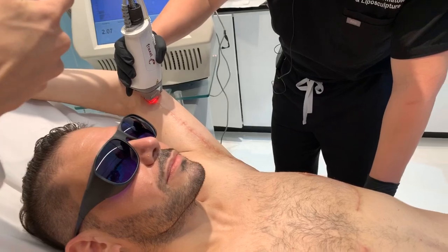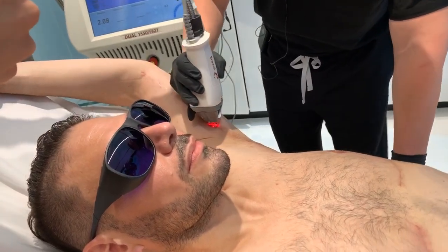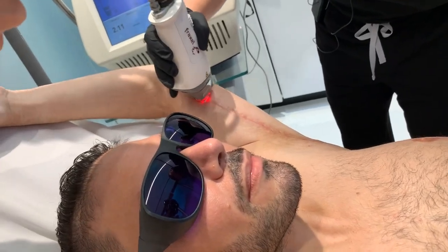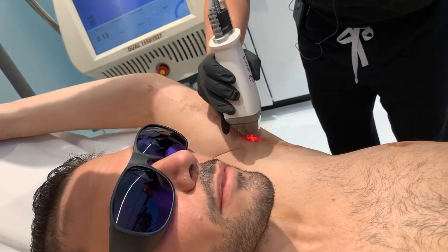And you can see as I roll, you get a little beeping. And that beeping is basically forming little dots of heat in the skin.